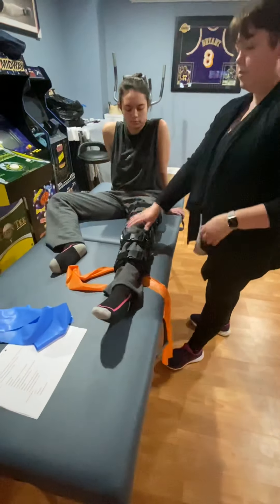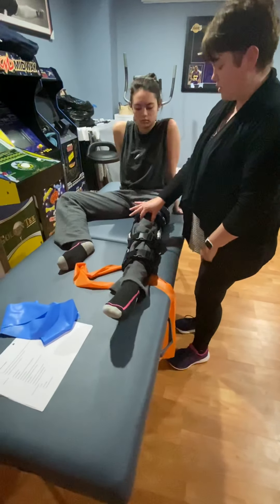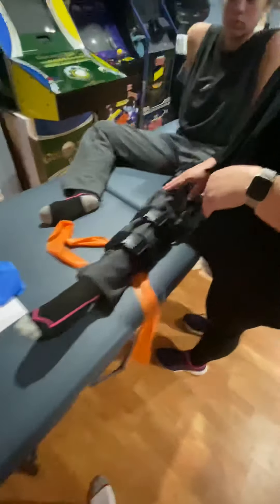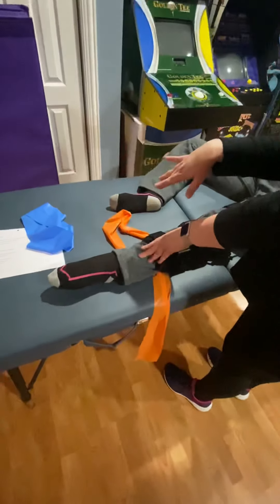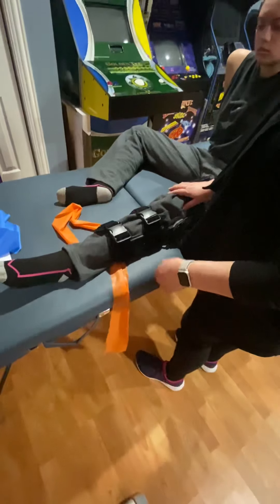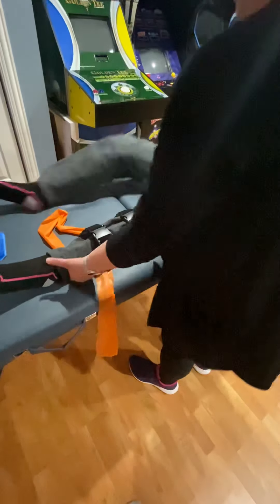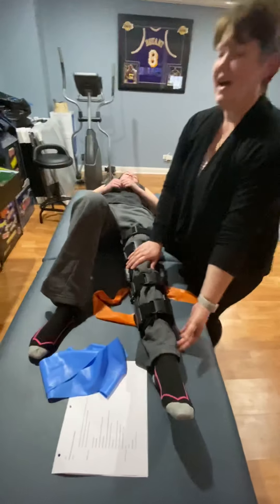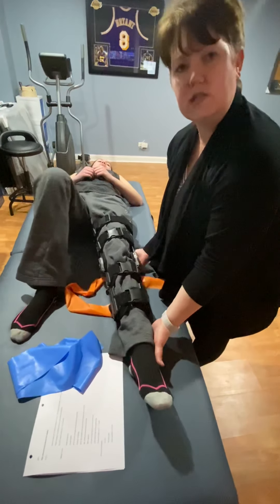While the brace is on, I can have my patient do quad sets — go ahead and straighten out your knee as hard as you can. Very nice. We can do ankle pumps: bring your ankle up and down, just flex and point — we do that for circulation. If she had a good quad set, I could do some active assisted straight leg raises.